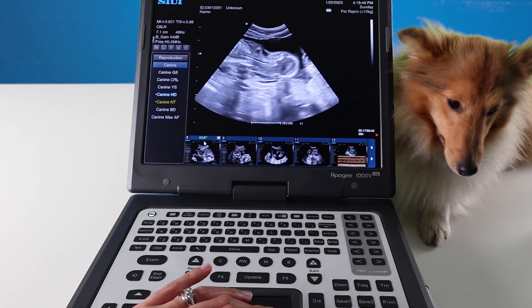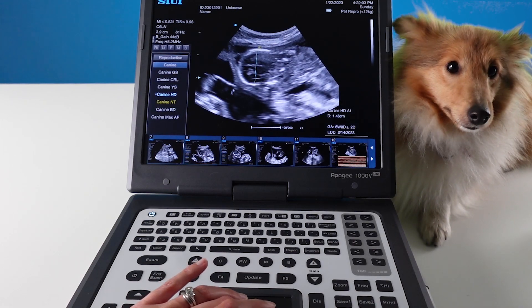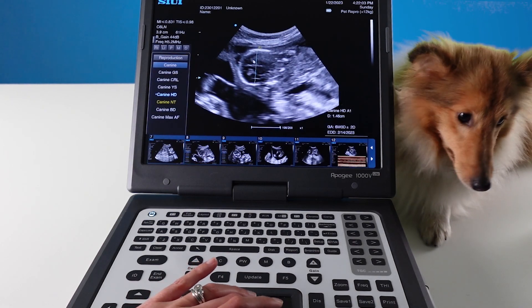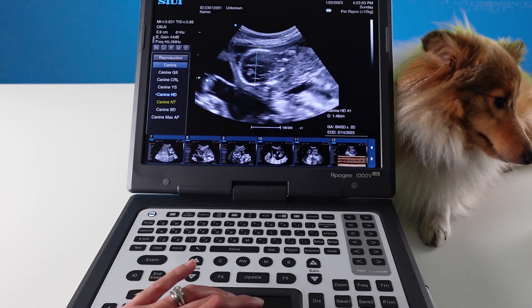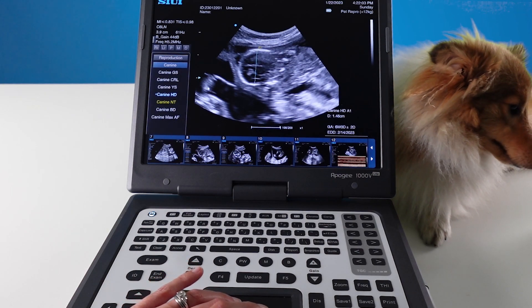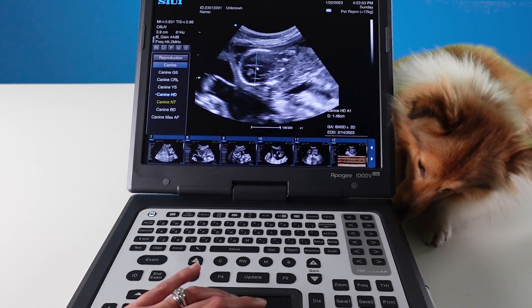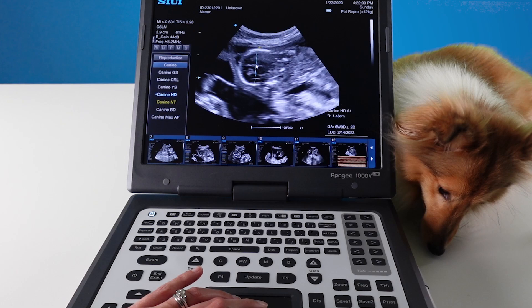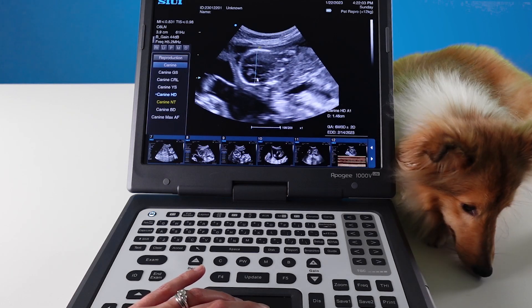Ideally you would reduce your depth in order to optimize your image. Make sure your focal point is in line with the area you are looking at, and try to see the midline of the skull so that you are measuring through it.